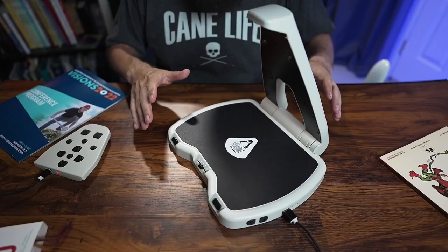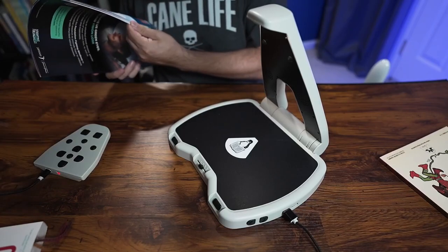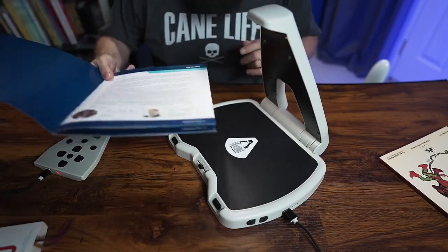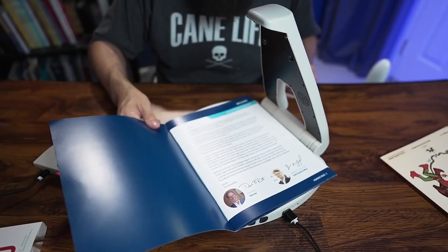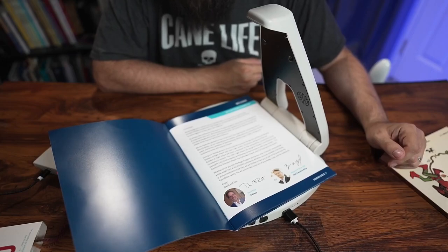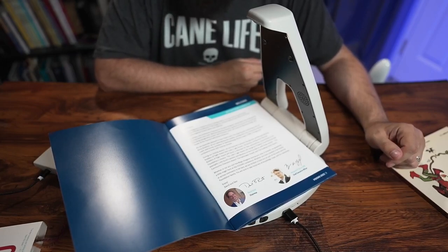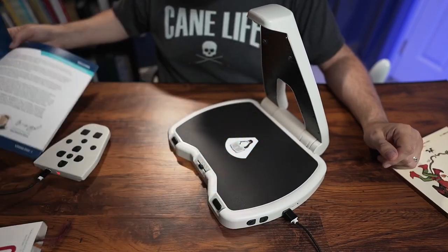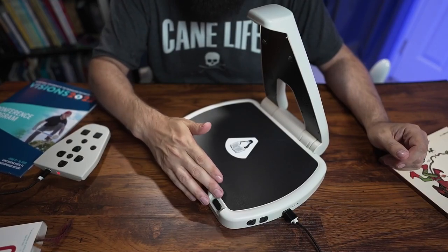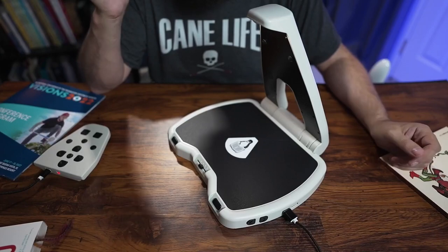Now what if you want to do the inside of a book? That's no problem. I've got a program from a recent conference. I just set it on there like that — it takes the photo and starts reading: "Dear friends, welcome. Letter from leadership. We are delighted to welcome you to Visions 202..." Super fast response. And then once again I can just press the button on the right side to continue listening.